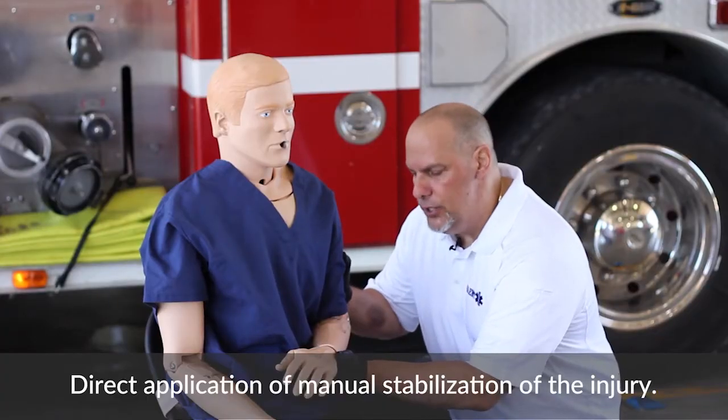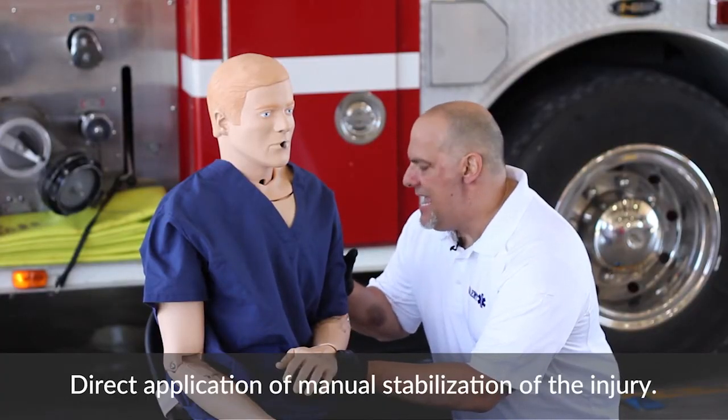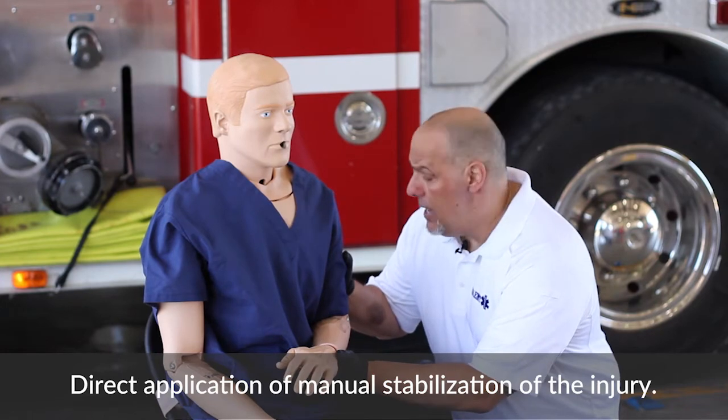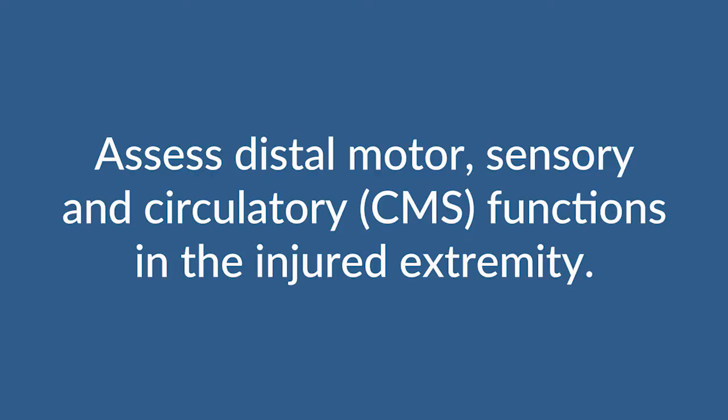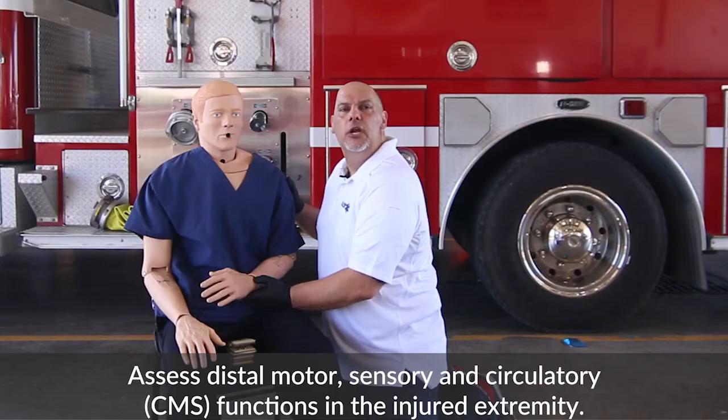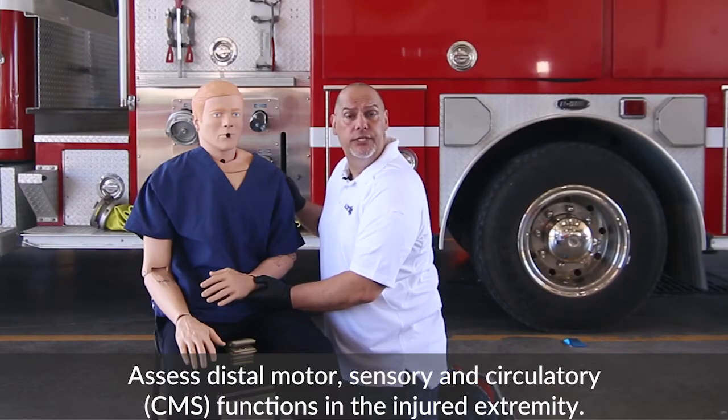I'm going to go ahead and hold this joint in place with my hand against the tricep muscle, and I'm supporting the wrist as well. You want to check for circulatory — pulses — you want to check for motor, and you want to check for sensory.